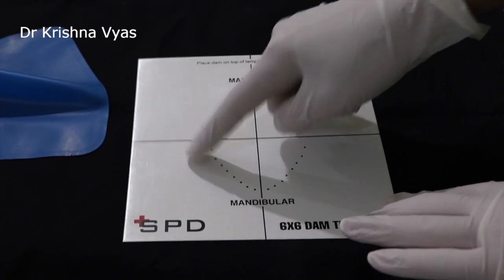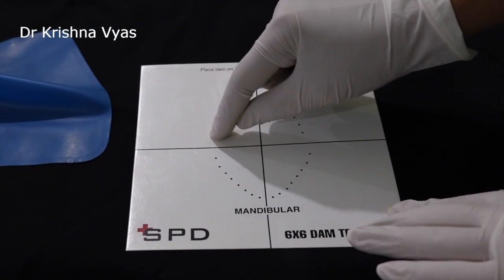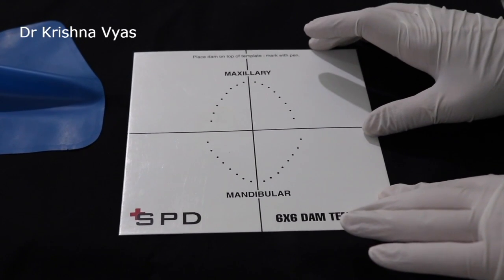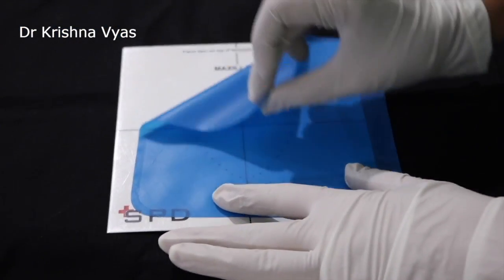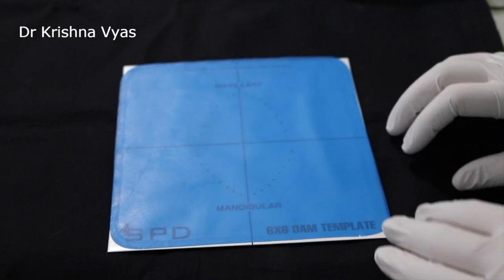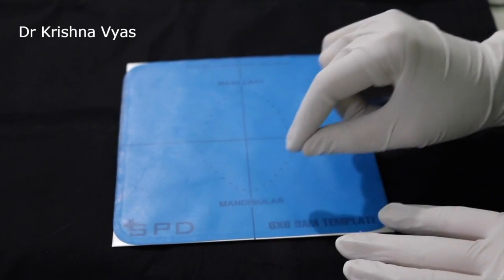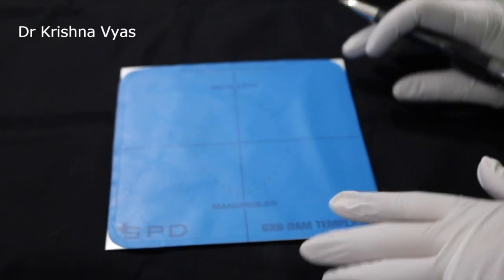This is the lower right quadrant and this is the lower left, starting from the central incisor to the third molar, similarly in all four quadrants. So whichever tooth we are going to work on, the first thing is we place the rubber dam sheet on this, facing the shiny surface down and the dull surface up, and position it in the center. Whichever tooth you are working on, you have to mark a dot on it, and to avoid confusion you can mark either the right side or the left side on the extreme top.